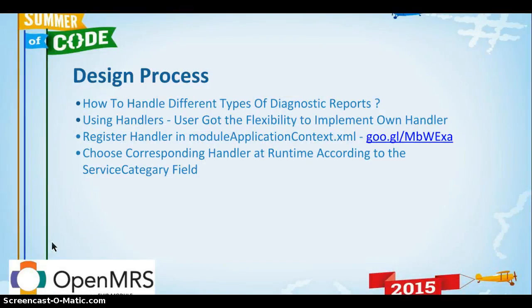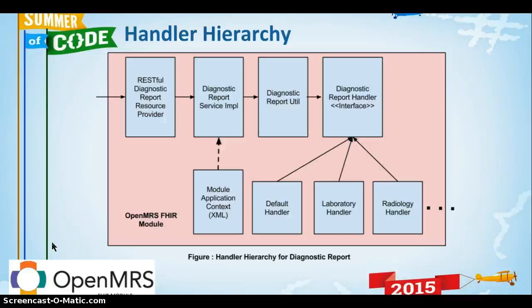So, how to handle different types of diagnostic report? To address this issue, we came up with a solution called handlers. Here is the handler hierarchy. When a client sends a request, it comes to the RESTful diagnostic resource provider.